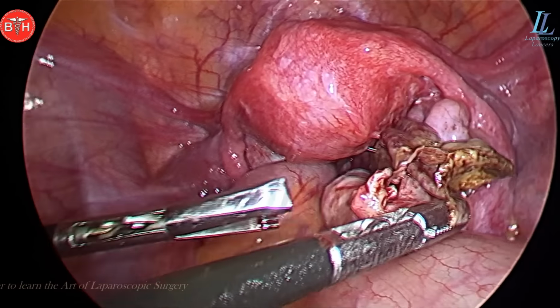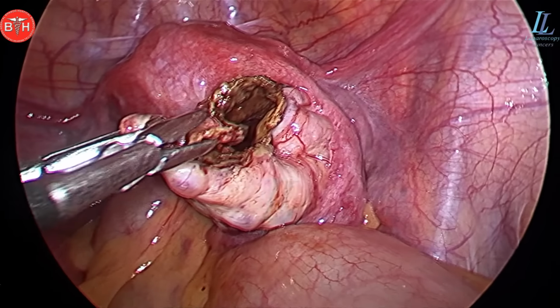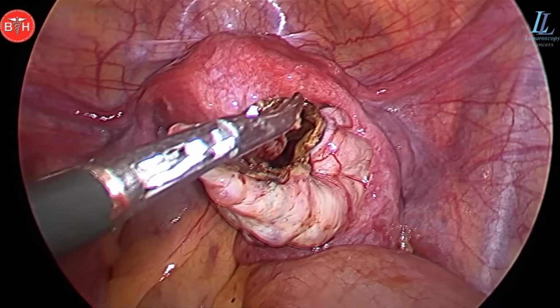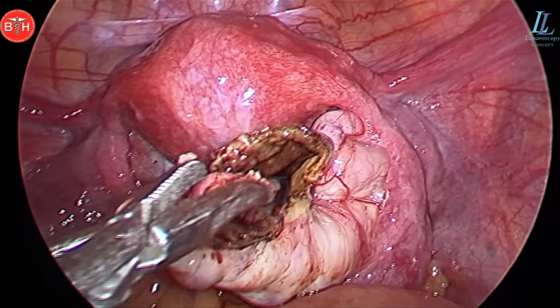The same can be done with dermoid cyst, simple cyst, and any type of cyst of the ovary if you want to save the ovary. Else, a salpingo-oophorectomy is the easiest option, but should not be tried, especially in young females, as the ovarian tissue has to be saved.